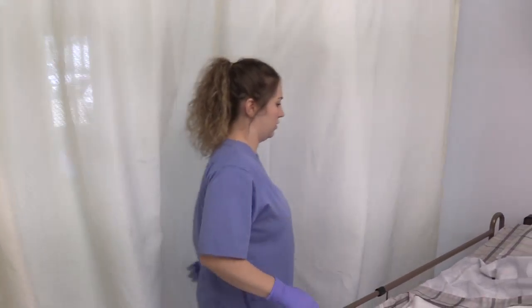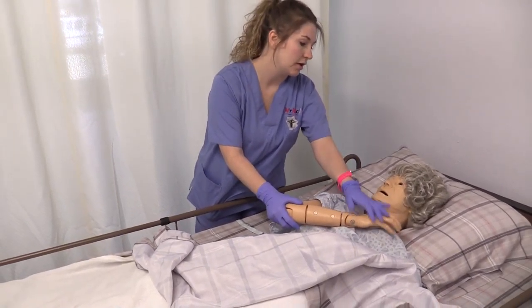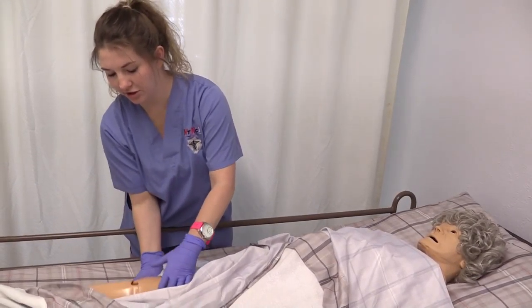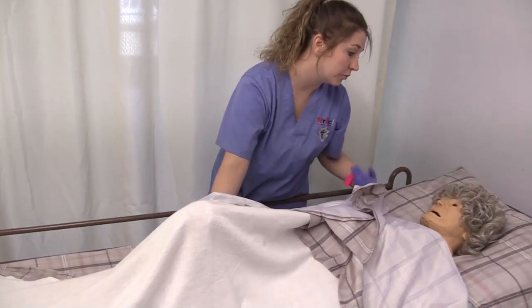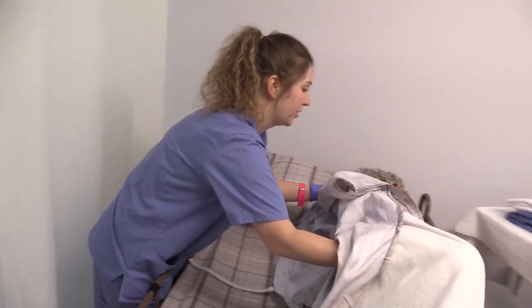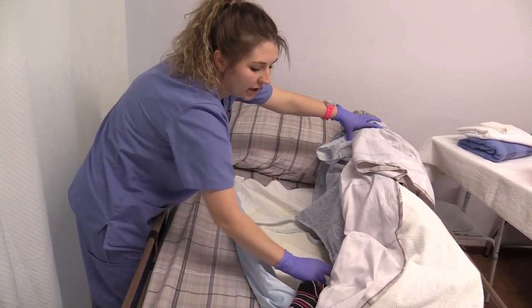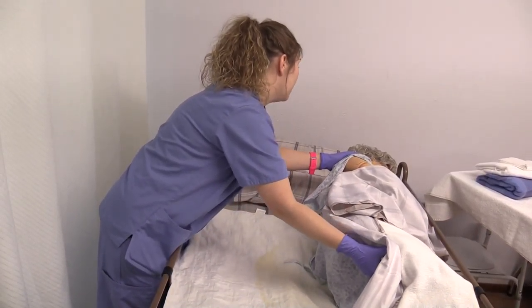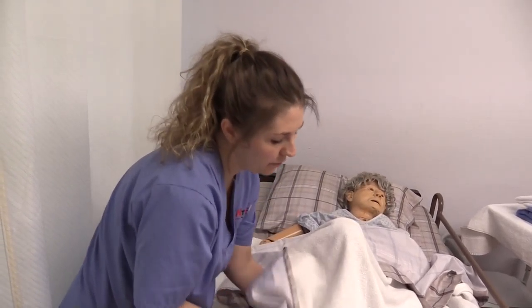Now I am going to go over to the other side. We are going to cross Miss Jane's arm across her chest. Miss Jane, we are going to roll you over to the left side. Make sure the patient's knee is bent by helping support it, keeping her covered. On the count of three, we are going to roll to the left side: one, two, three. Then you will pull the rest of the pad towards you, again making sure that the catheter does not get caught. Miss Jane, you can roll on back — one, two, three. You can relax her arm and relax her leg.